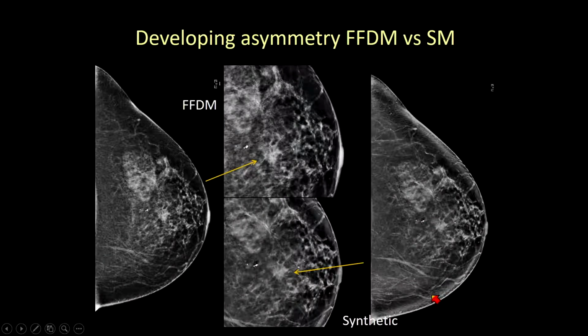The synthetic shows us spiculation when it's associated with that distortion, with that asymmetry. This patient has this central asymmetry here, and I have the full field cropped compared to the synthetic. You can see the distortion quite well on the synthetic. It really pops at us. And remember, that's because the algorithm is designed to enhance that feature.